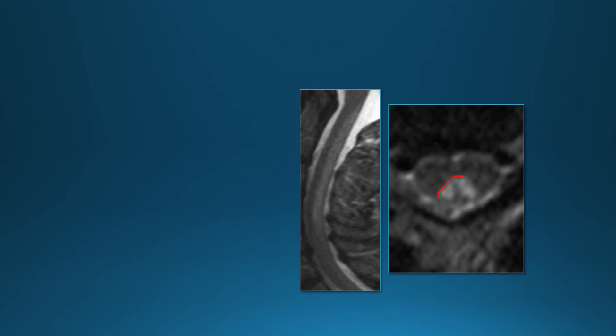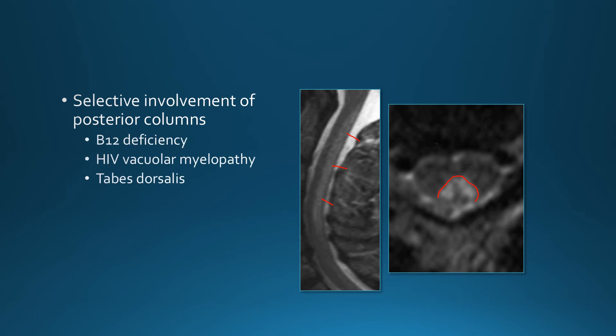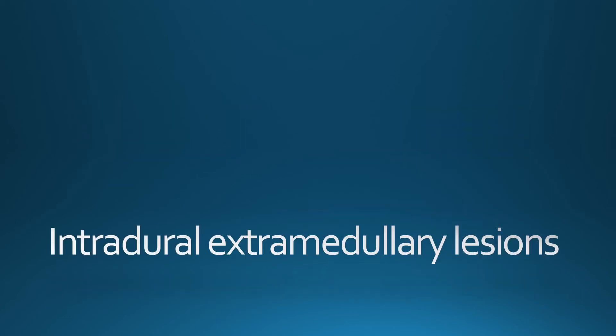This patient has abnormal T2 signal fairly limited to the dorsal columns, visible on sagittal images — selective involvement of the posterior columns. Three things can cause this: the classic is B12 deficiency, it can also be seen in HIV patients (possibly also related to B12 deficiency), and tertiary syphilis — tabes dorsalis — also involves the posterior columns. This transitions us to intradural extramedullary or leptomeningeal lesions.